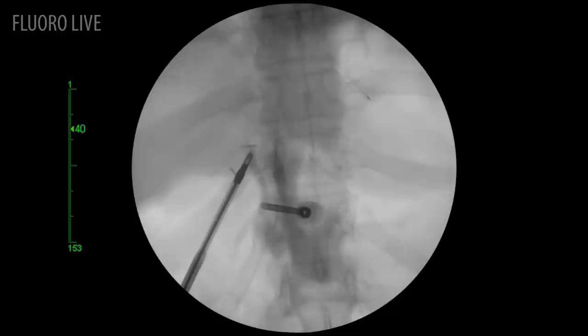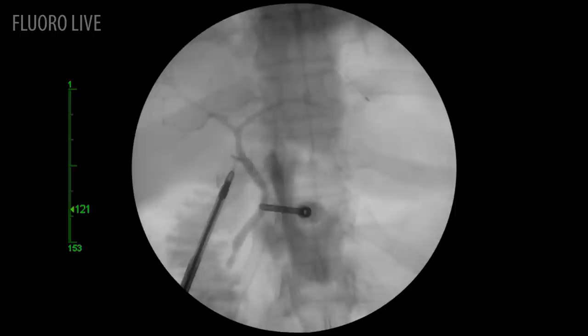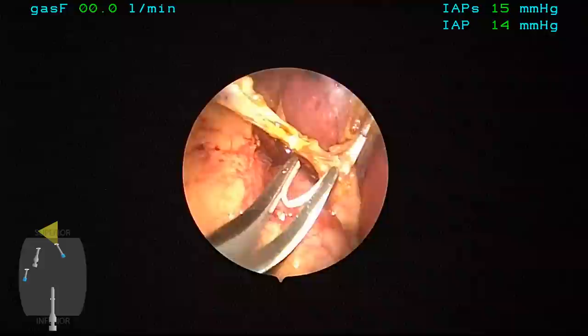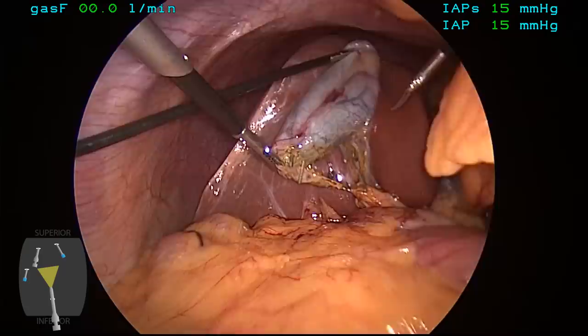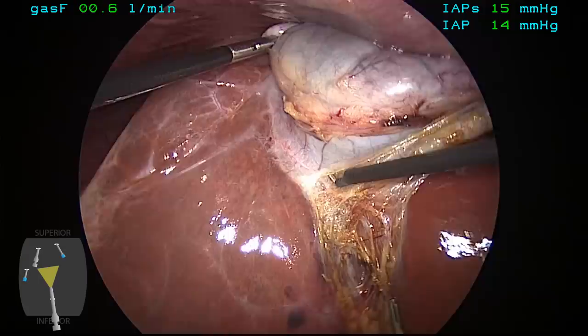We use a mixture of Conray 60, 50-50 with saline. The dye is injected slowly, first to see the detail in the cystic duct, and with the contrast going into the duodenum. There's a little bit of overlap of the distal clamp, so that's repositioned so you can see the entire ductal system. The cholangioclamp has now been removed, and we're now clipping the cystic duct from the umbilical port site with two clips on the stay side. It's important to make sure these go all the way across. If there is a thickened cystic duct, or distal obstruction, or if you've removed a stone from the bile duct, our recommendation is to use an OPDS loop suture to secure the cystic duct and avoid cystic duct stump leak.